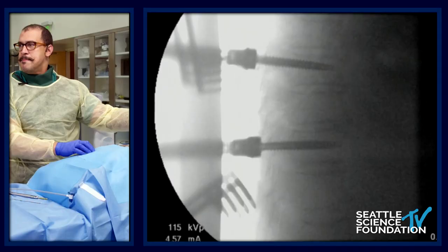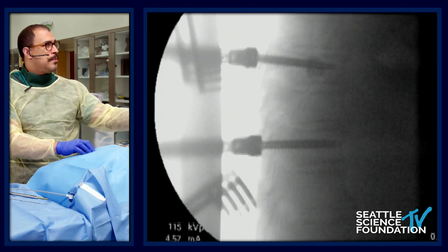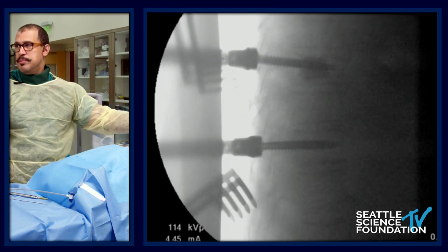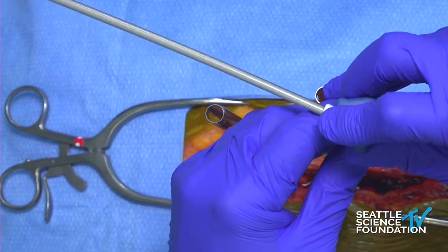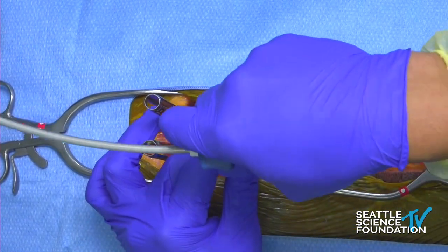So first we've got to prime this, and it's something you want to keep using. We're already getting that cement coming out. Probably two turns — one more? That looks like plenty of cement. We'll go to our next screw. I like to stagger so that we can make sure we've got our best visualization.